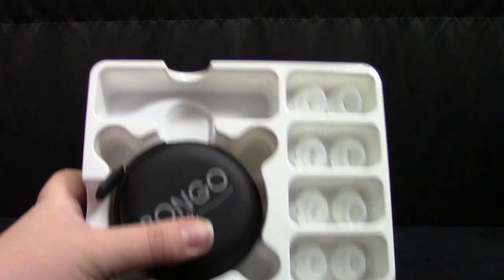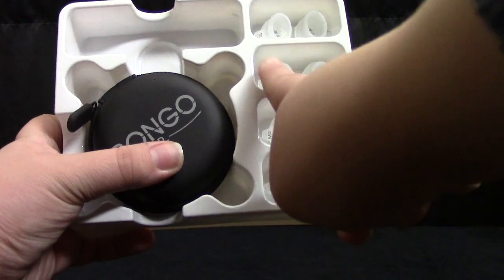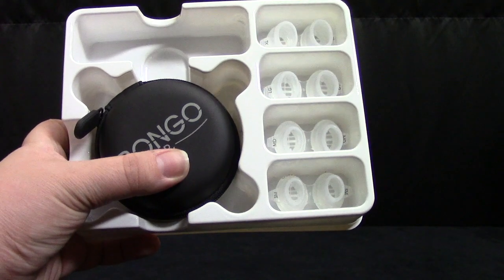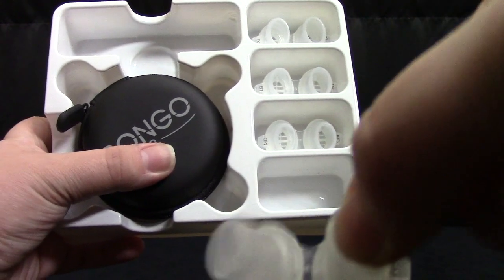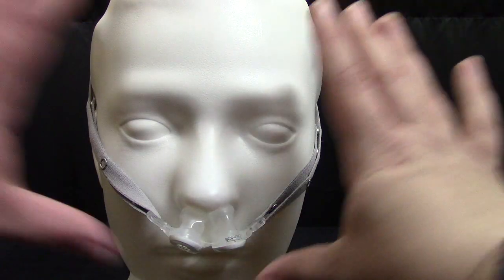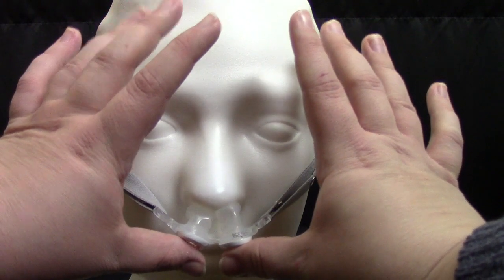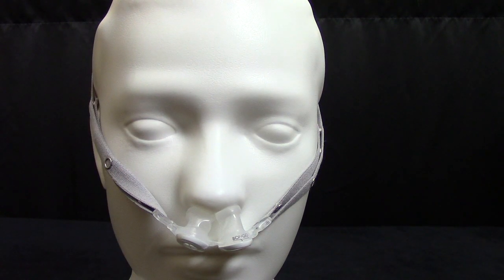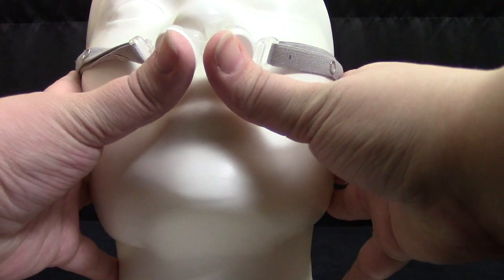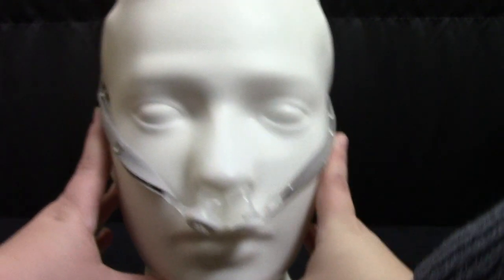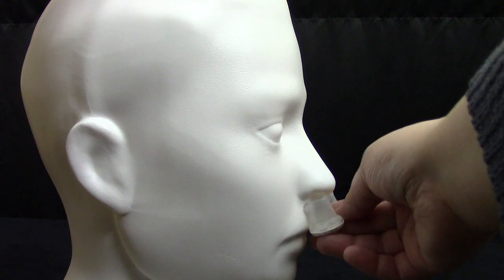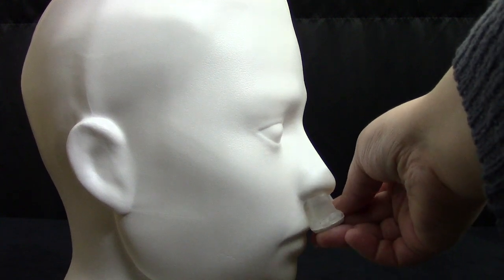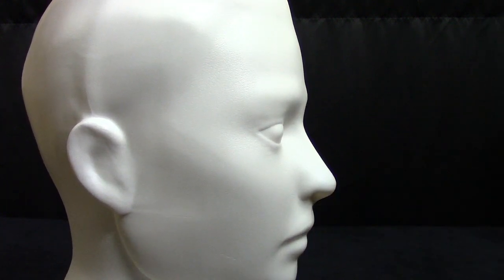To test out the starter kit and find your proper size, start with the smallest size of Bongo RX and gently insert into your nasal passage. Check for leaks by placing two fingers at the bottom of the device and exhaling. Should you feel a leak, try the next size up. Keep repeating the process until you've located an appropriate size that does not leak.